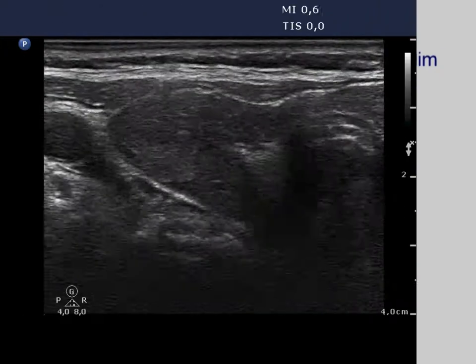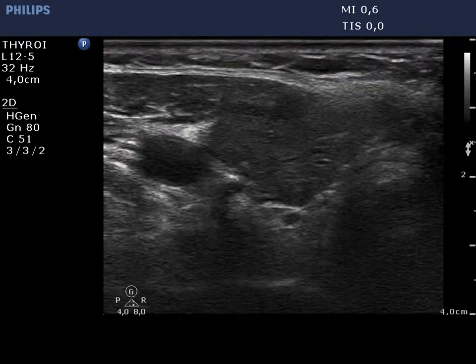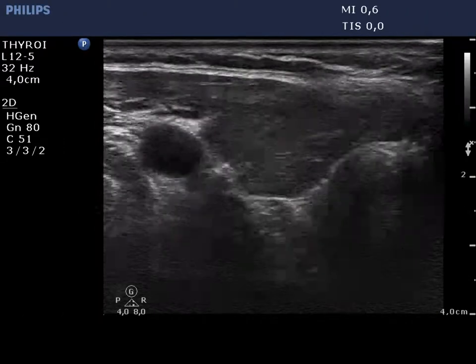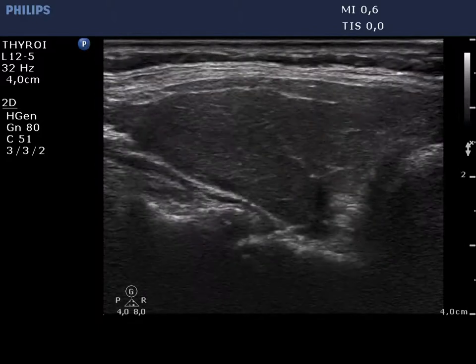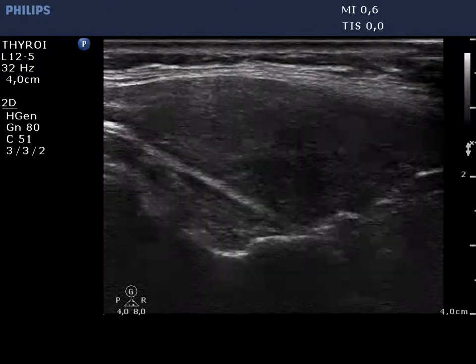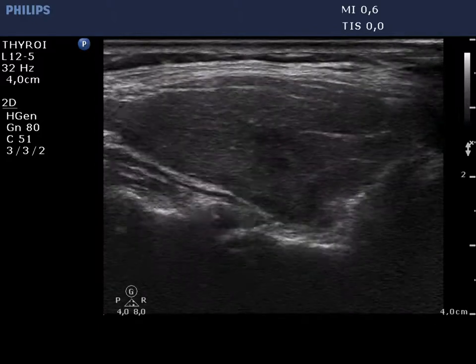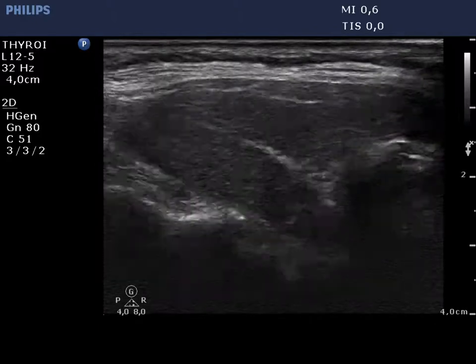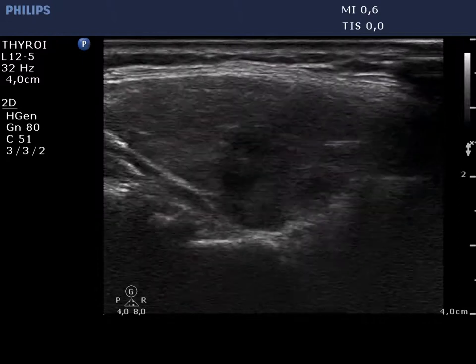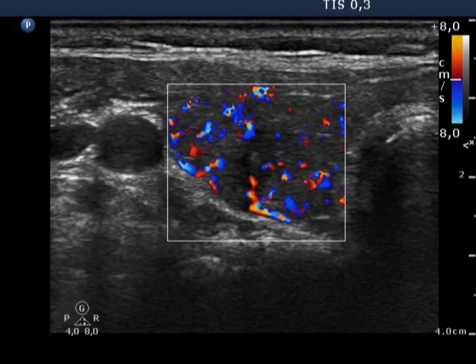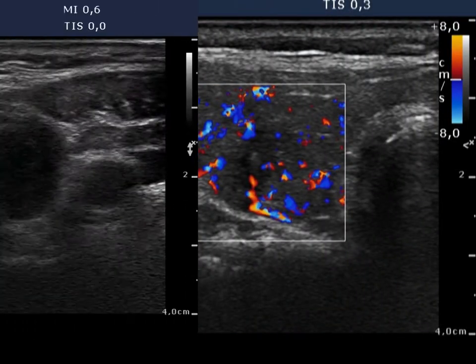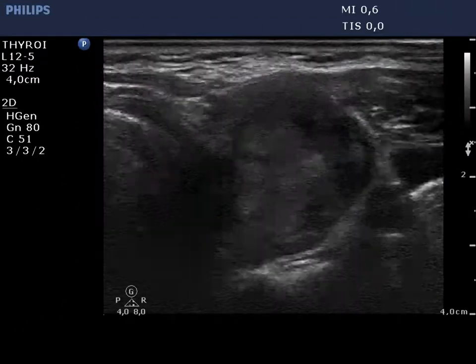The right thyroid is hypoechoic and contains several small, insignificant, more hypoechoic areas. The vascularization is increased.